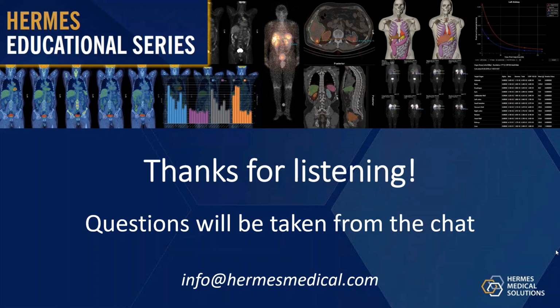Yeah, for example, the hospital where I work, we have done whole body, well, 3-bed bone SPECT CT studies, quantitative, for I think 4 or 5 years already. We don't do planar studies anymore because with Hermes you can reproject the SPECT data into planar studies.